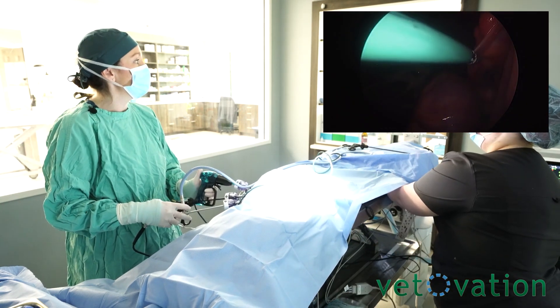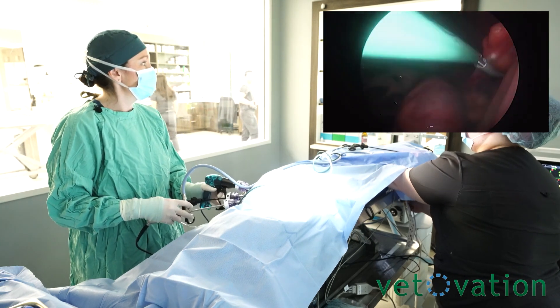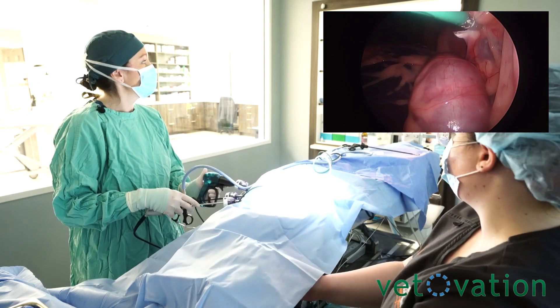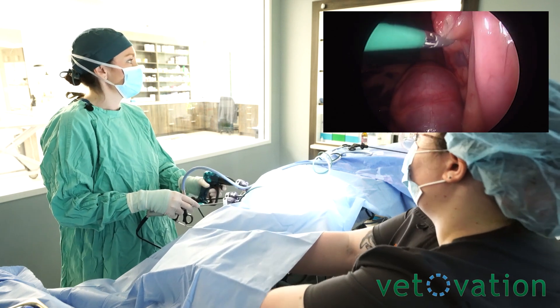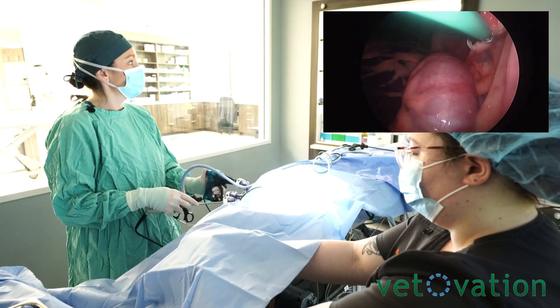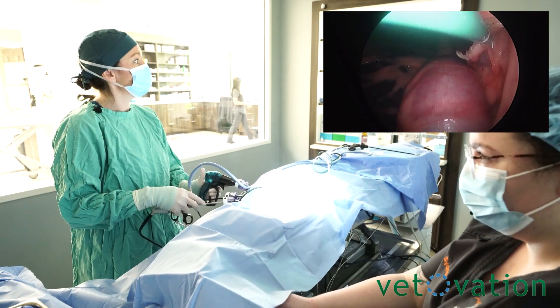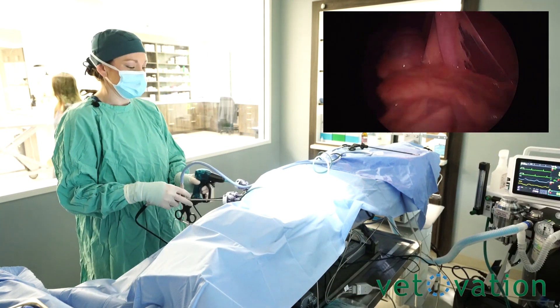Here you're clamping on the suspensory ligament. The instrument clamps all the way and then you're depressing the thumb button with your finger. You're hearing the beeps go through their cycle, and then you're sliding the blade to transect the tissue with your trigger finger, and then you just go get another bite. Dr. Simpson's camera is in her most caudal port, her vessel sealer is in her most cranial port, and her graspers are in her middle port so that she can pull up on the ovary. Because we're suspecting this dog has a pyometra, we're going to do an ovariohysterectomy and free up all of the suspensory ligament pedicle.